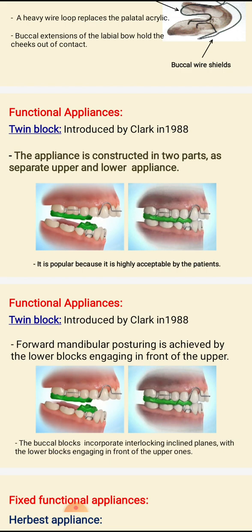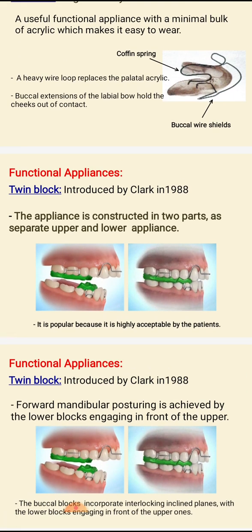This made the appliance popular among orthodontic patients. It is highly acceptable to patients because eating and speaking are easier with the Clark twin block appliance.